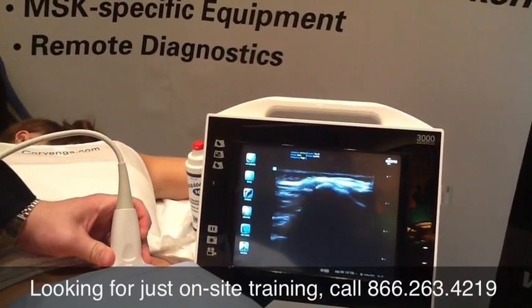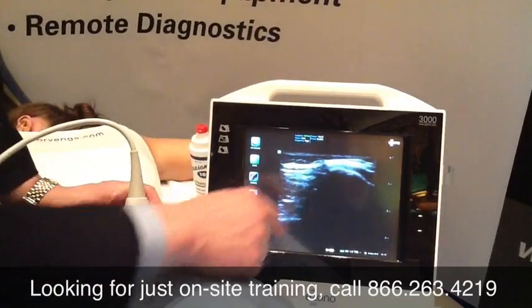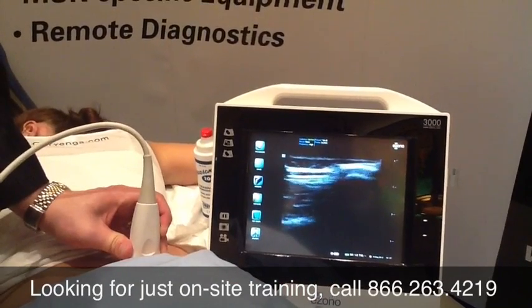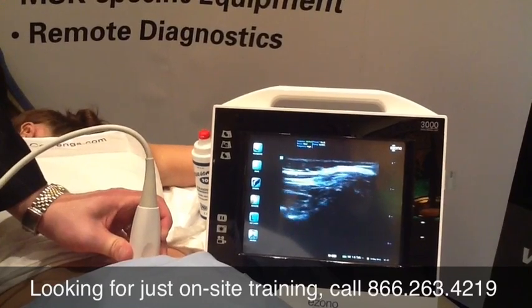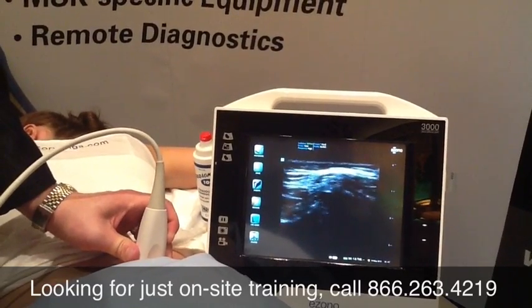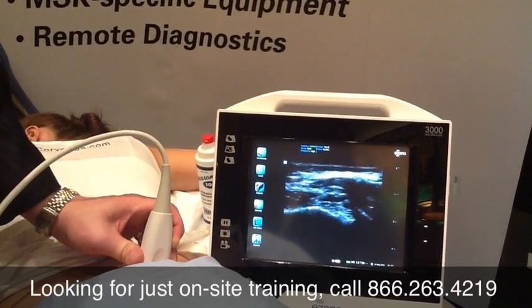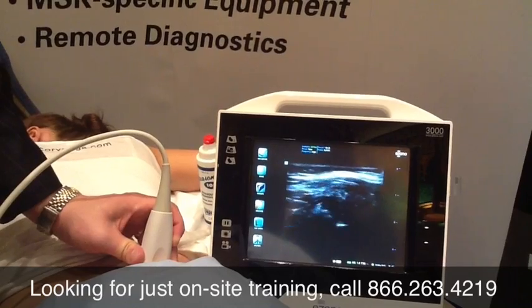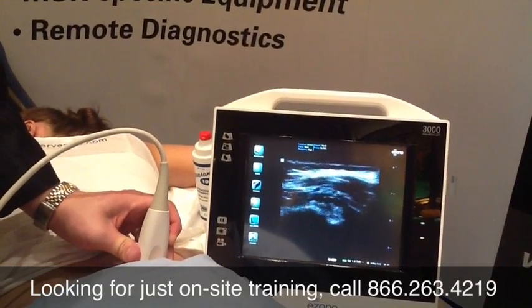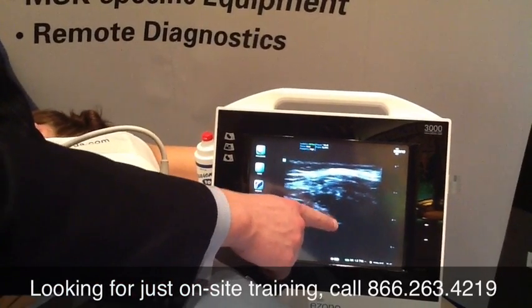Starting out by the PSIS, I'm going to scan caudally. I'm going to watch the iliac crest, with all the shadowing, drop down as I go caudal. One way to do this injection is to go just past where the ilium disappears. So it's gone here, and as I bring it back, I see the shadow. I'm catching shadow here, and I see the sacrum here.